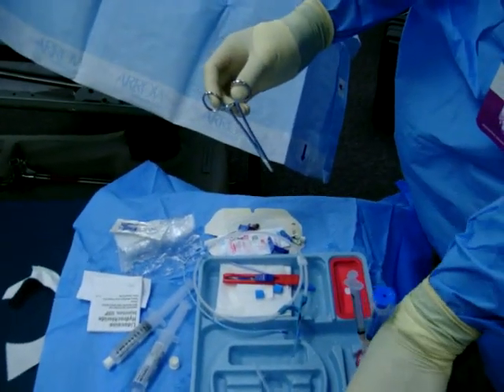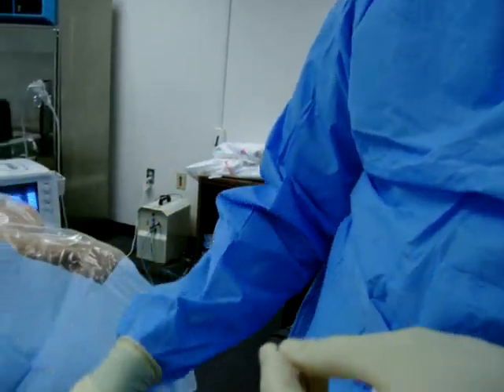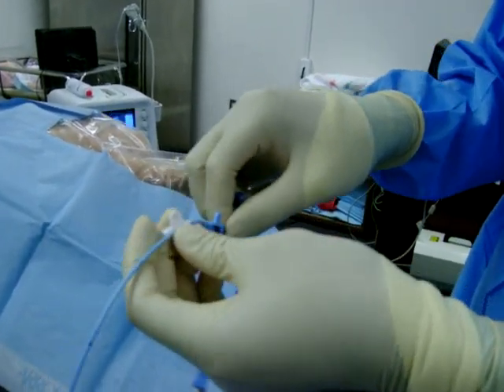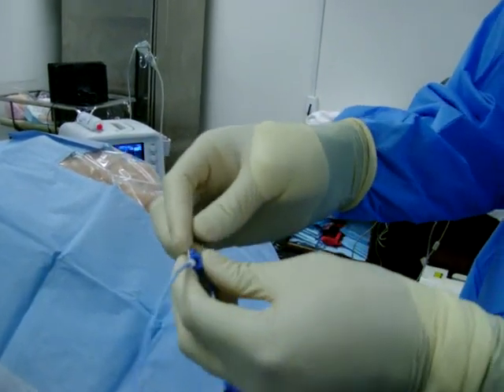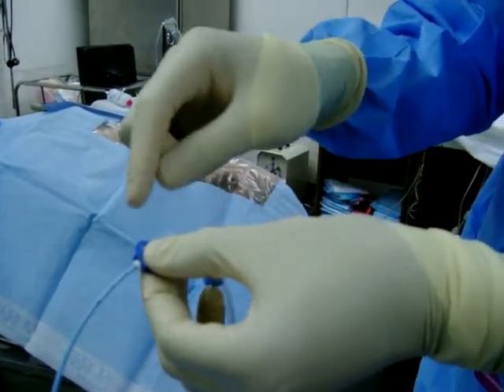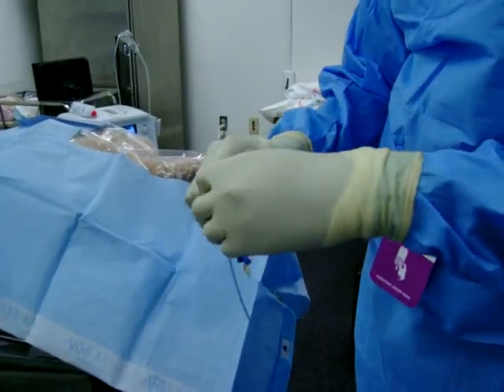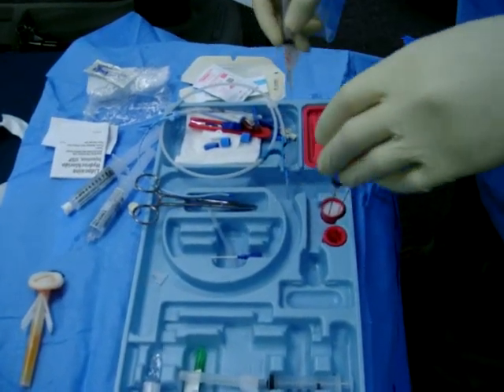You also have some clamps here. If you're doing a line on an 80-year-old lady that's 5 feet tall, you may need to secure the line at a point lower than the deepest point. It has a butterfly attachment that goes over and would lock the catheter in place. You would stitch this to the patient — I usually throw a stitch and wind it through here in case it gets tugged on, so it's anchored at that initial stitch. This is only for patients with smaller stature, so the line is not in the right ventricle causing ectopy.